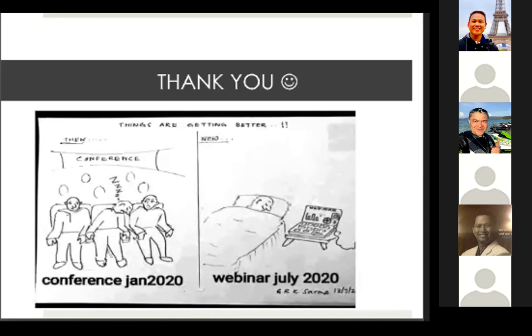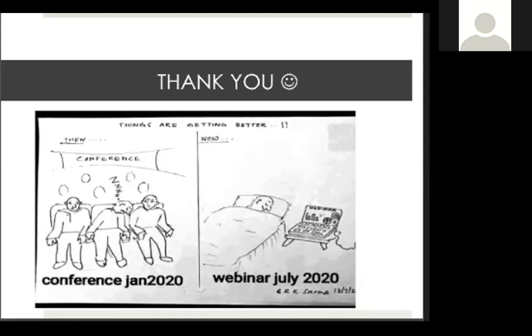What if his first sensation is 300 ml? Is that normal? It's abnormal, sir. Maybe non-compliant. No, not non-compliant. It's too compliant, because the volume value is already so high. So it's very compliant.